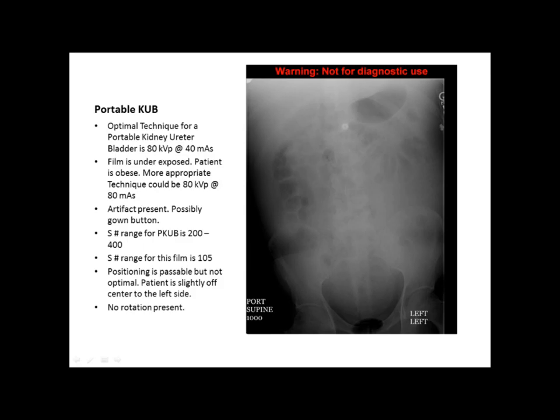The typical S number range for a portable KUB is between 200 and 400. The S number on this film is 105, which is below the acceptable range. The positioning is passable but not optimal — the patient is slightly off center to the left side. There is no rotation present.